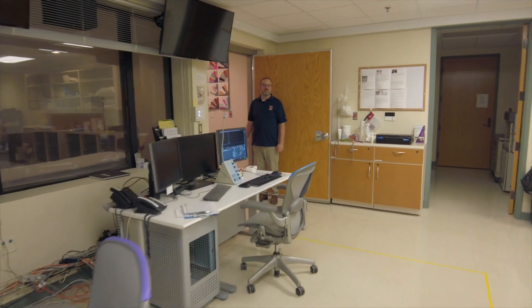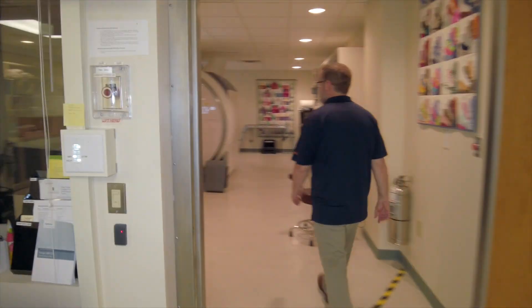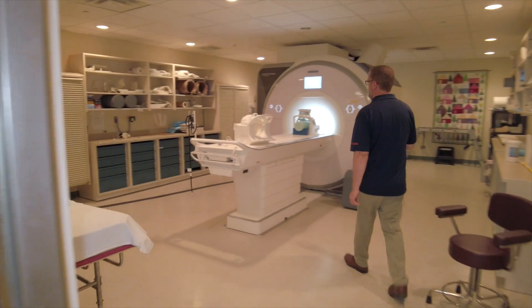Hello, I'm Brad Sutton. I'm a professor in bioengineering, but I'm also technical director of the Biomedical Imaging Center. I'm going to show you one of our two 3T Prisma systems that we use for a lot of our human subjects research, animal imaging, or even other sample imaging. So come on in.